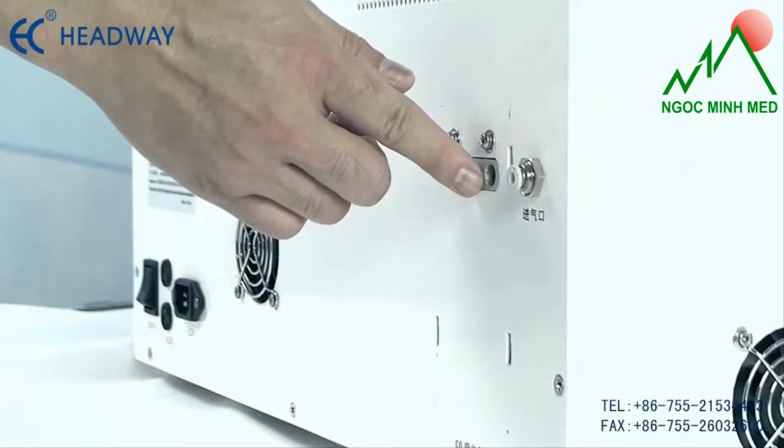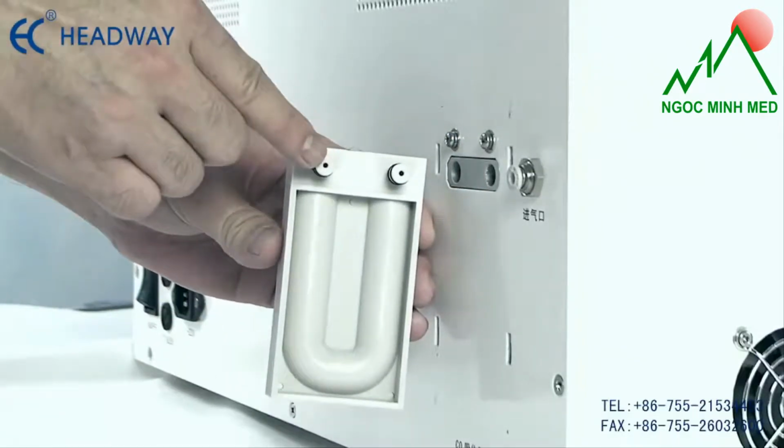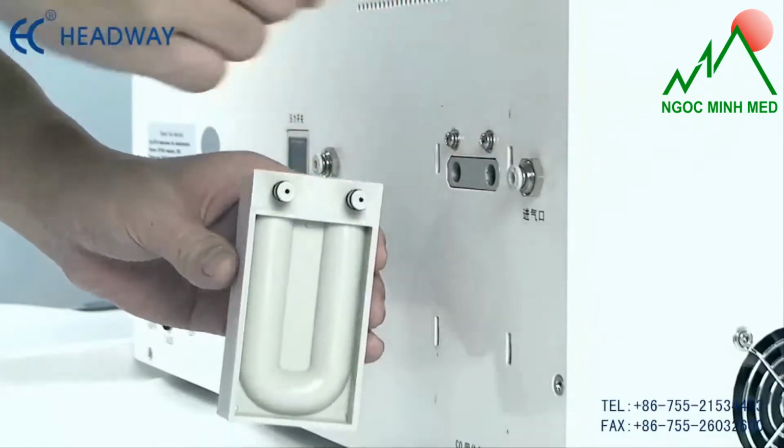Installing the filter. Remove the protective cap of the filter connectors. Insert the filter into the filter interface. Make sure it is inserted to the end.